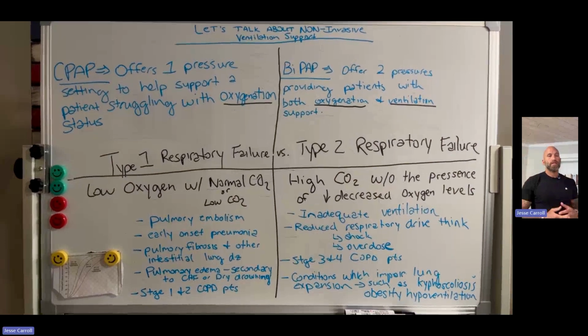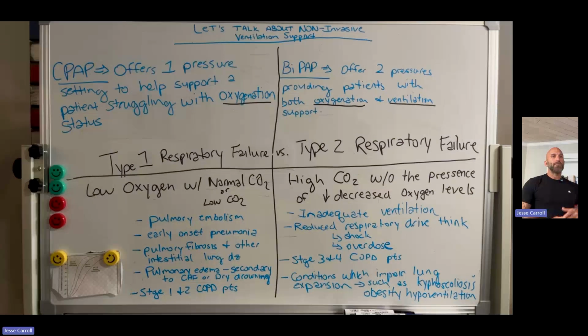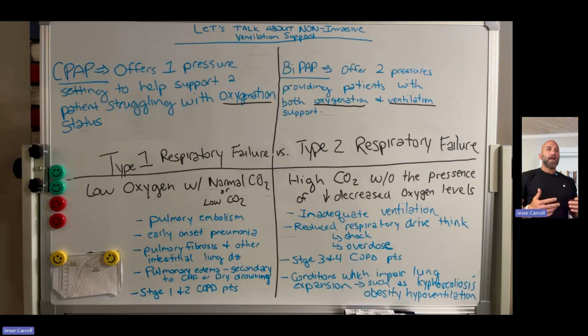So real quick, down and dirty deep dive: CPAP offers one pressure setting that will help to support the patient struggling specifically with an oxygenation status issue, whereas BiPAP actually offers two pressures, providing the patients with both oxygenation and ventilation support.